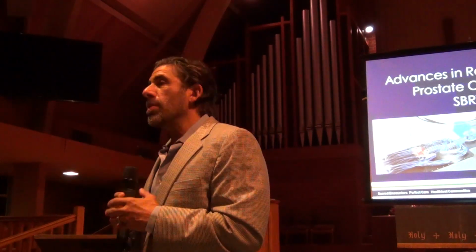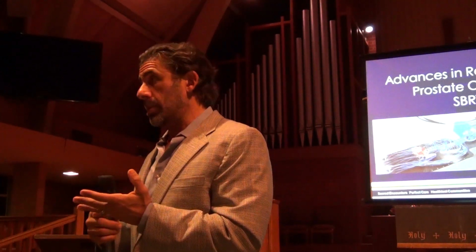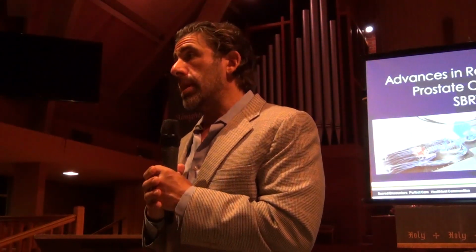Well, the purpose of the water, and we all do it, we all follow very similar protocols, is to fill the bladder up, to be one, reproducible daily, but also it pushes the small bowel out of the radiation field. If you imagine your bladder being extended, you also get less dose to the bladder. If your bladder was empty, it would be flat like a pancake, and you would have most of the bladder in your radiation field, and you would get an unacceptably high dose to the bladder.